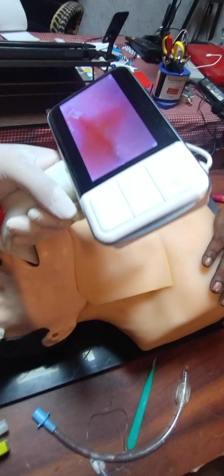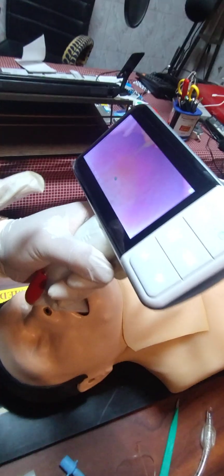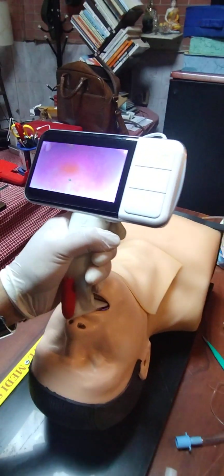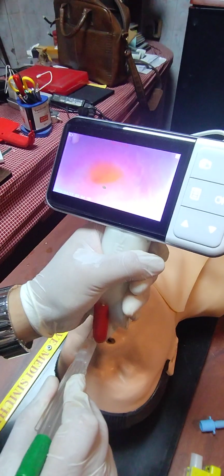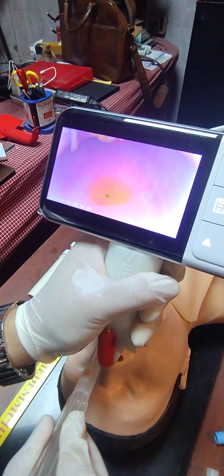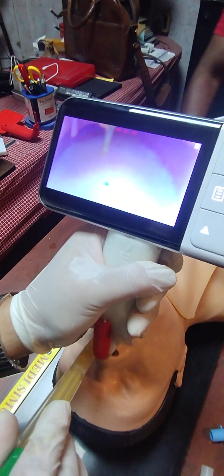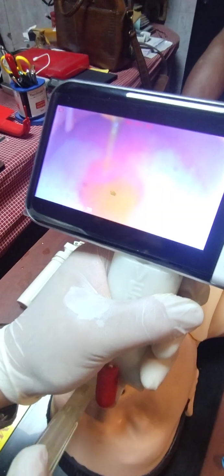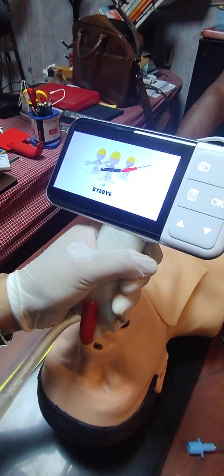Now do the vomiting, pour. So now you will see vomitus coming. Okay. Give one more time. So from left side. Pressure. Yes. So keep suctioning. So you can increase your suction.